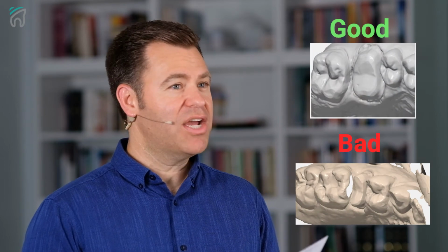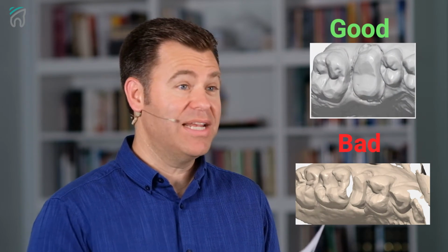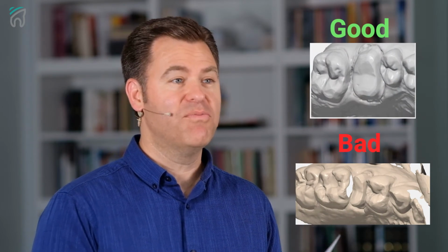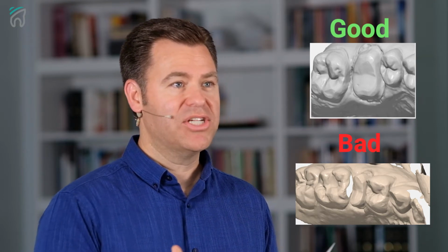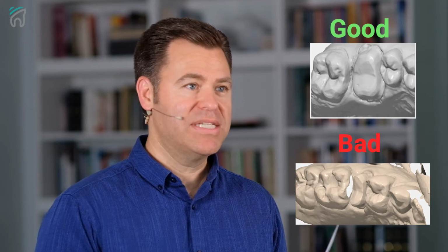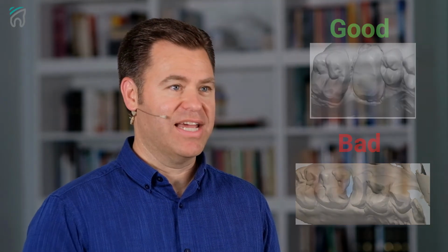The next one is in the area of the contacts, the adjacent contacts of the teeth. If you'll just check from different angles, it's hard to capture, and then it's also hard sometimes to notice if you've missed data. And so all the way through as you scan and then before you send it, check and make sure that there isn't any missing information on the adjacent contacts.